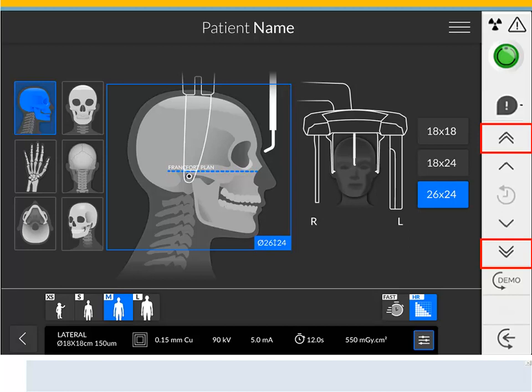Fast Height Adjustment Button: Press and hold up or down for fast adjustment of the height of the unit to the height of the patient. Slow Height Adjustment Button: Press and hold up or down for slow adjustment of the height of the unit to the height of the patient, especially for the final adjustment.